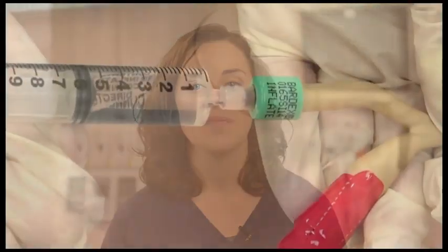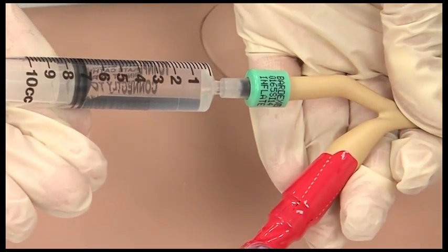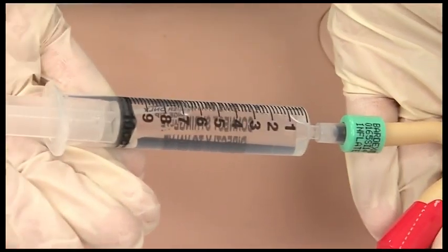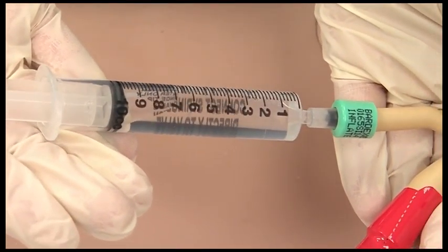Gently insert a Luer lock or slip-tip syringe in the catheter valve. Never use more force than is required to make the syringe stick in the valve. Allow the pressure within the balloon to force the plunger back and fill the syringe with water. If you notice slow or no deflation, reseat the syringe gently. Use only gentle aspiration to encourage deflation if needed. Vigorous aspiration may collapse the inflation lumen, preventing balloon deflation.